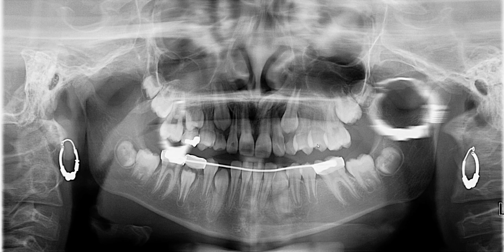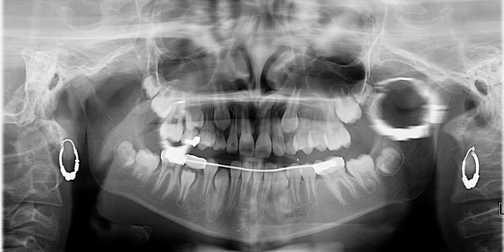Number 13 is fully erupted. However, look at number 4 — isn't it interesting that it's slightly delayed, just like what we see in the mandible. This may explain something about the eruption sequence of the body. We would ideally like to see eruption occurring on both sides, but in this case the eruption pattern seems to mimic both maxilla and mandible. There's a slight delay on the right side compared to the left side.